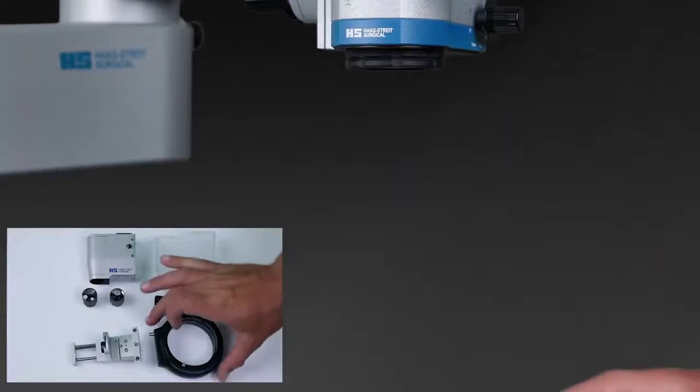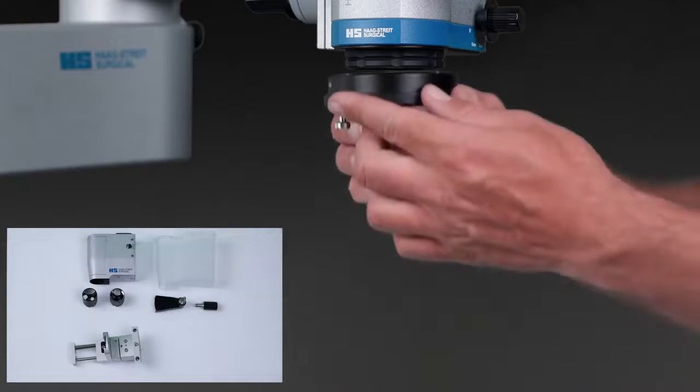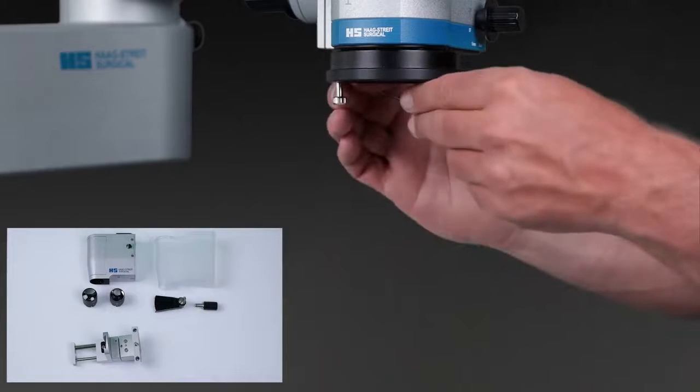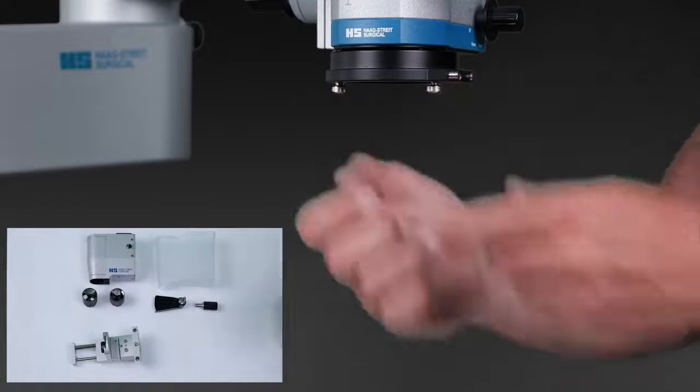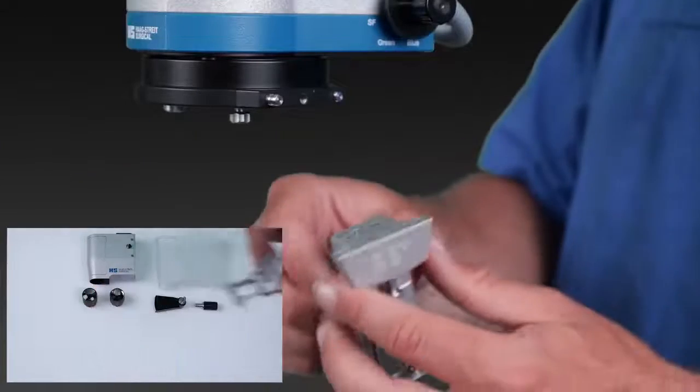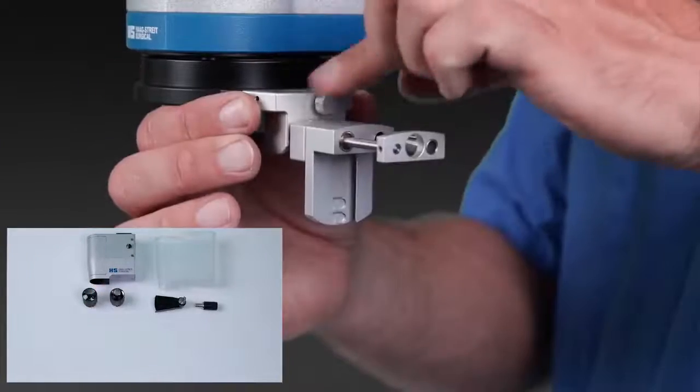The installation is quite simple. The mounting ring is connected to the microscope via two screws. Then the suspension is attached to the adapter via one screw.